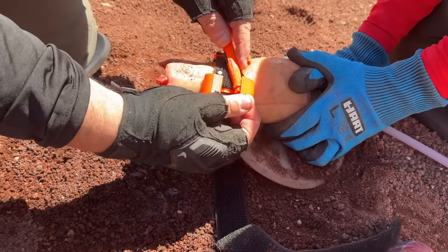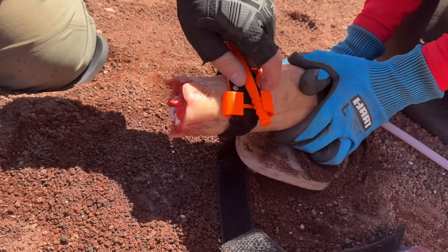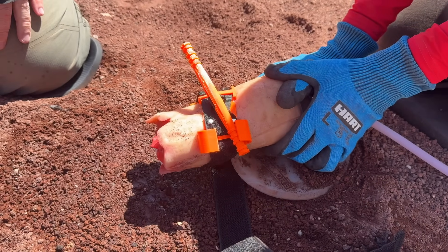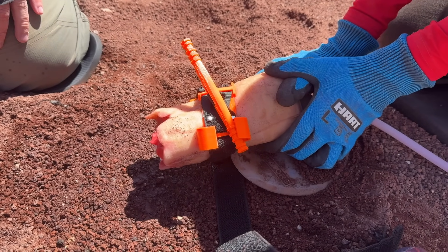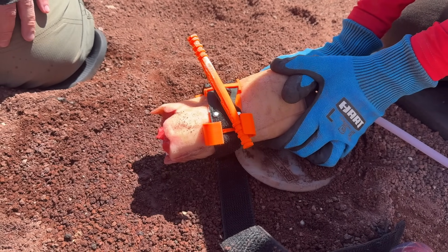The windlass is what will actually stop the bleeding and cause occlusion. Then clip it into the clip. You may still see a little flow — that's just what's left in the limb. At that point, the patient is going to be screaming in pain, not only from the wound but also from applying the tourniquet, because these things hurt, and you want to stop them from trying to take it off — but that's a whole other topic for another day.